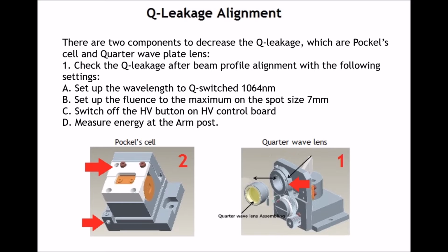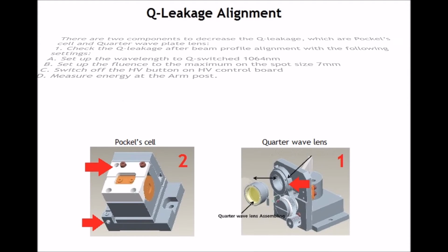1. Check the Q leakage after beam profile alignment with the following settings. A. Set up the wavelengths to the Q switched 1064 nanometer. B. Set up the fluence to the maximum on the spot size 7 mm. C. Switch off the high voltage button on high voltage control mode. D. Measure energy at the arm post.